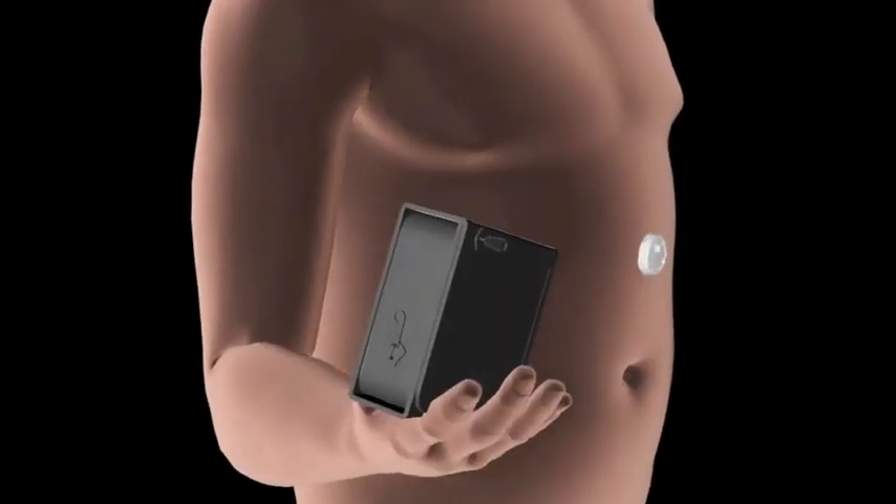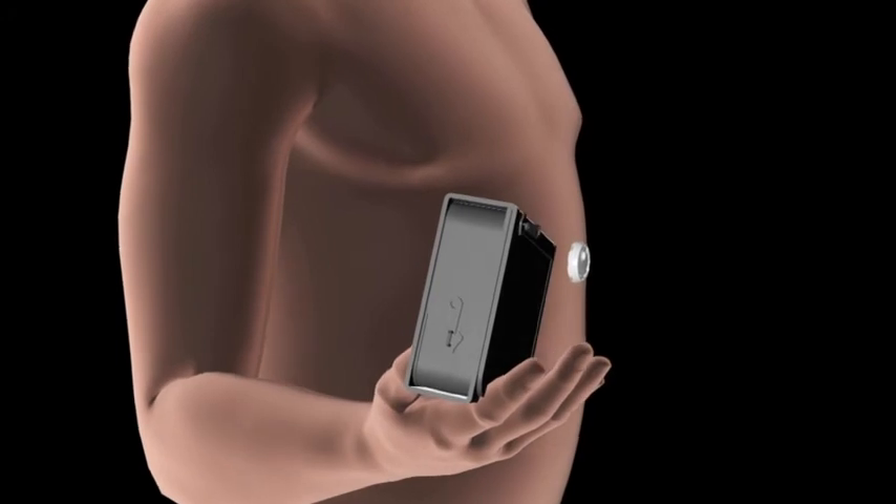Afterwards, the Aspire Assist can be stored back in a small carry bag for your convenience.